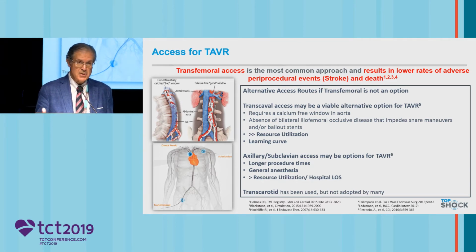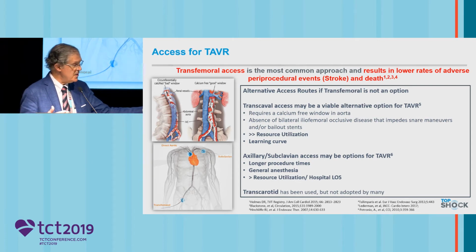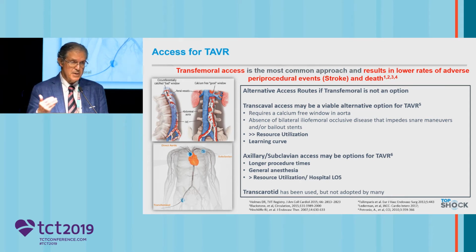We have a tremendous experience with this, but even in our hands, it's more general anesthesia, more resource consumption. Transcarotid, I think, and that was raised here a couple times, at least for the TAVR case. We've done a dozen of these. It's an excellent direct access, but it's general anesthesia, more resource consumptive.